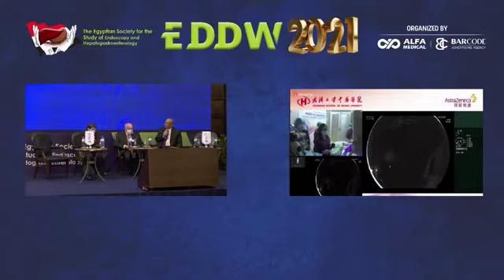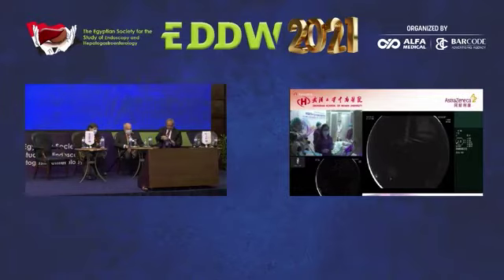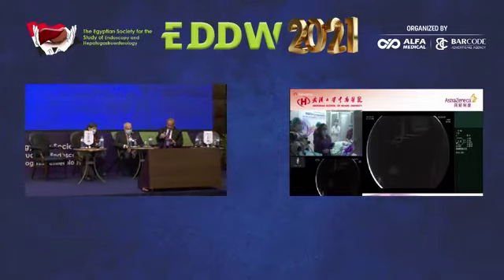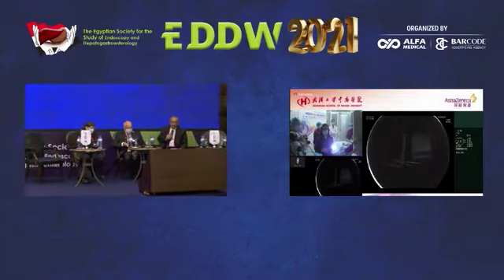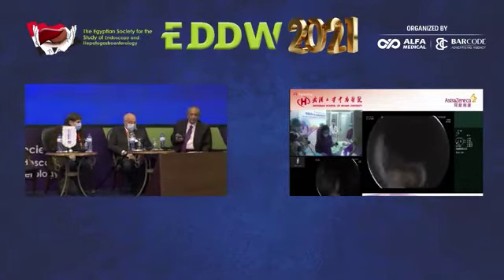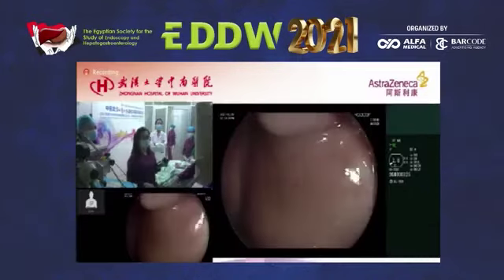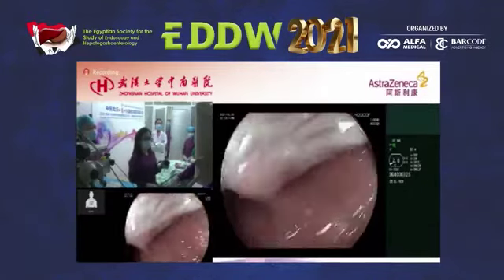I'm Jia Lian from Wuhan University Zhongnan Hospital. Today, I'm going to demonstrate AI-assisted upper digestive tract endoscopy. The instruments are a Fuji 700 endoscopy and an AI system from Hellan Xuanwei Tang Medical Information Technology Company. Let's begin.